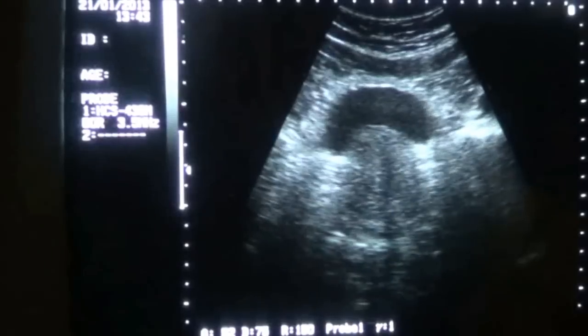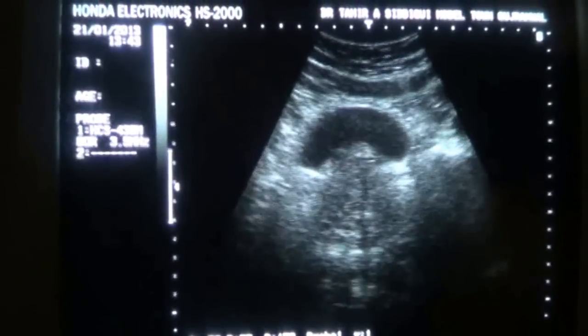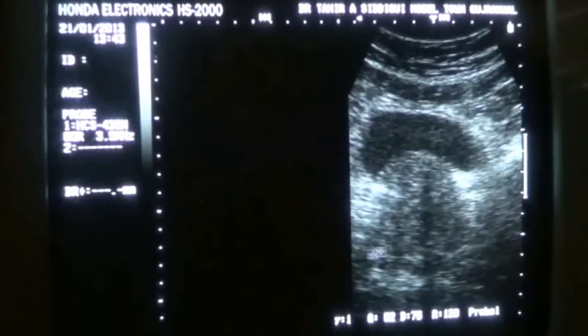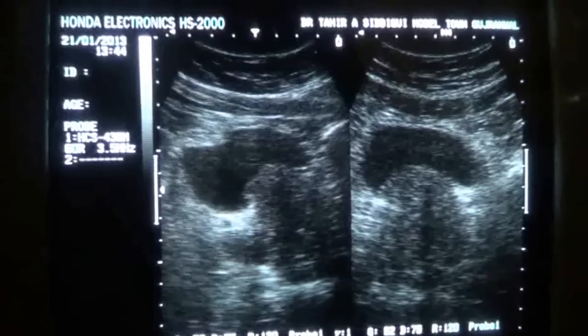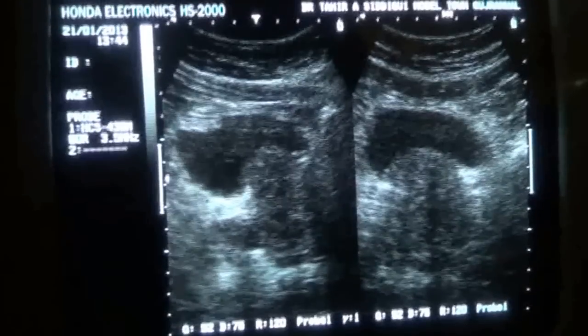I am just giving a slight angling of the probe towards the patient's feet and I get the transverse view of the prostate. This is the transverse of the prostate with intact periprostatic fat and no calcifications seen. This is the prostatic urethra and this is the substance of the prostate in transverse section. Now I will give a 90-degree angle to the probe and we will get the longitudinal view of the prostate.